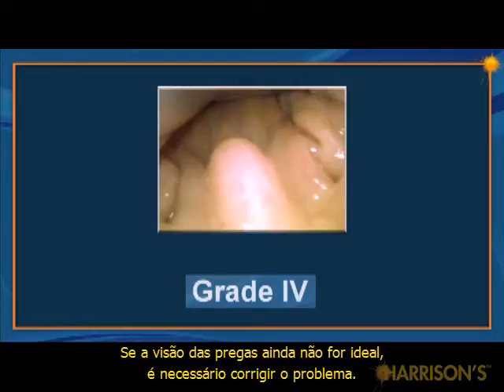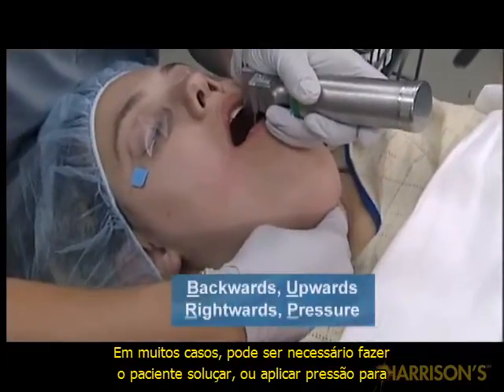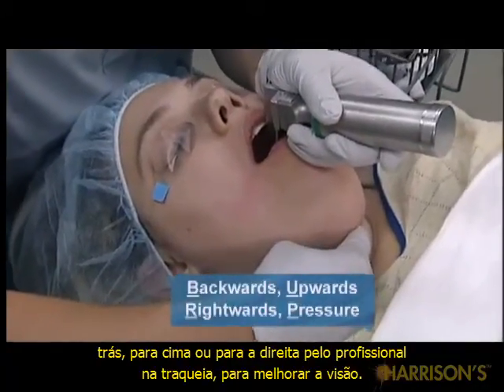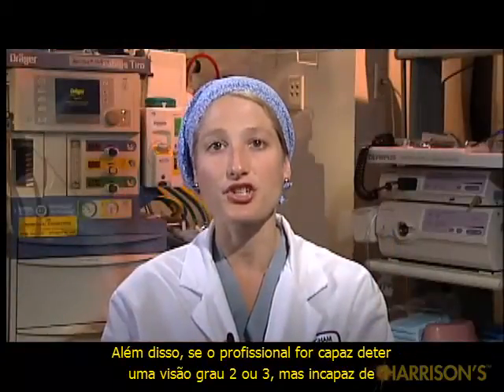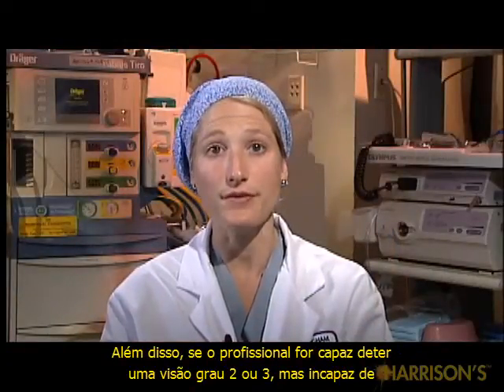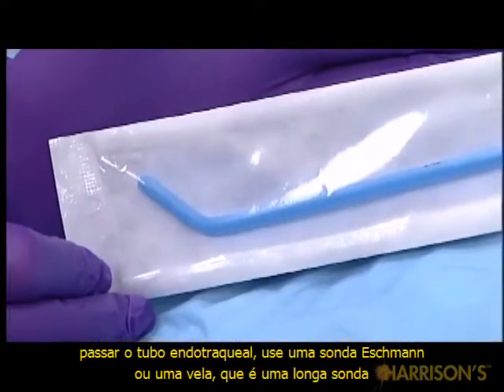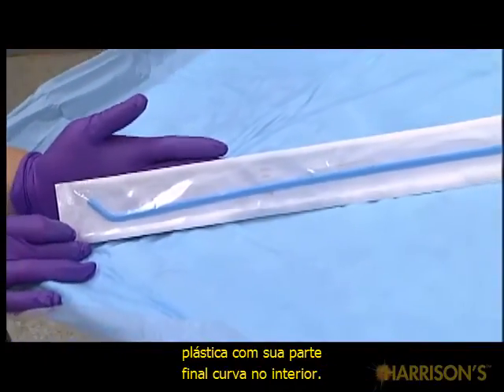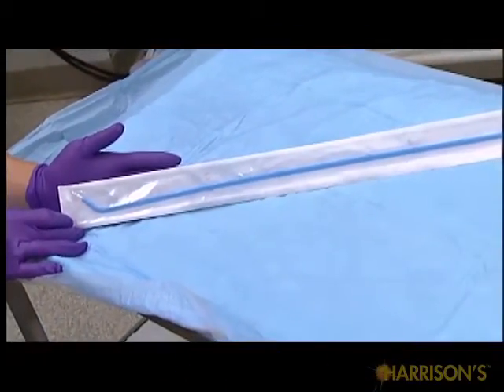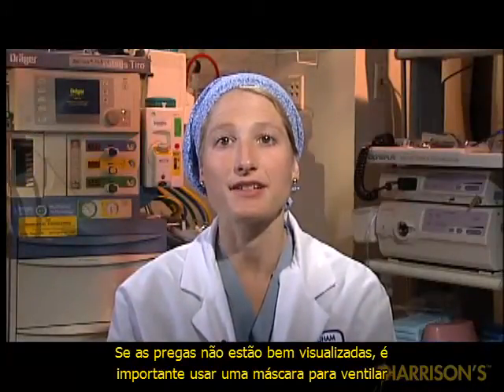If the view of the cords is still suboptimal, troubleshooting is necessary. Often BURP, or backwards, upwards, rightwards pressure, can be applied by the practitioner to the trachea to improve the view. In addition, if the practitioner is able to see a grade 2 or 3 view but unable to pass the endotracheal tube, use of an Eschmann stylet or a bougie, which is a long plastic stylet with its end curved anteriorly, may be considered.